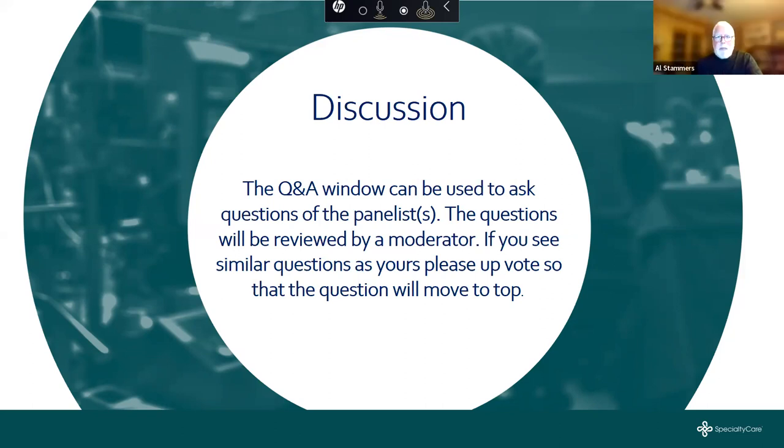Let me follow up, Alex, is that okay if I ask Dr. Ündar a question on his use of neuromonitoring? That seems to be a really developing field. The TCD, the EDAC, and others are great, and you really have promoted the use of transcranial Doppler as being beneficial. The question that I have is, you're doing EEG monitoring. It was part of the indices that you used. Had you considered somatosensory evoked potential, which we also know is used in operating rooms, specifically for individuals undergoing aortic procedures? Do you have experience or comments on that particular modality in the pediatric population?